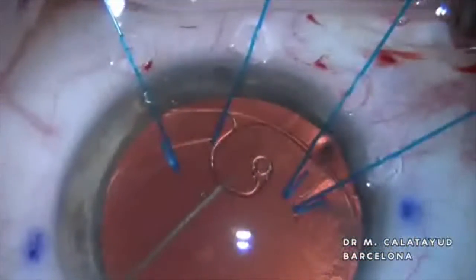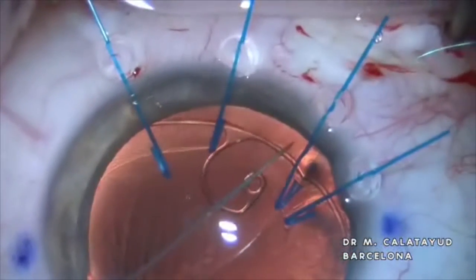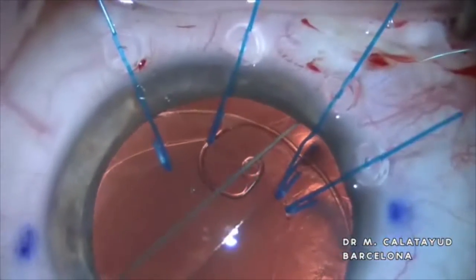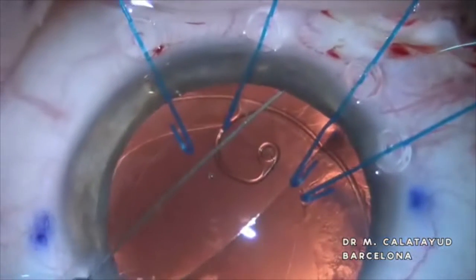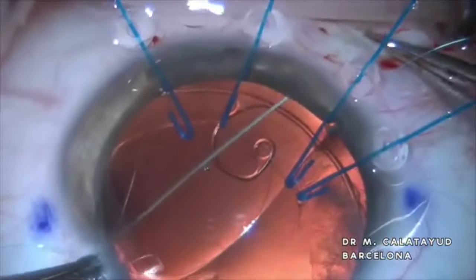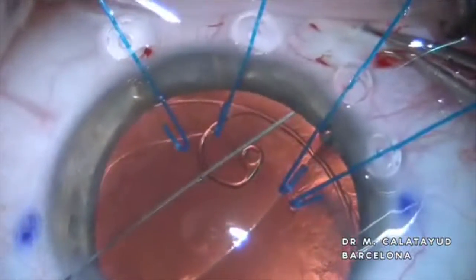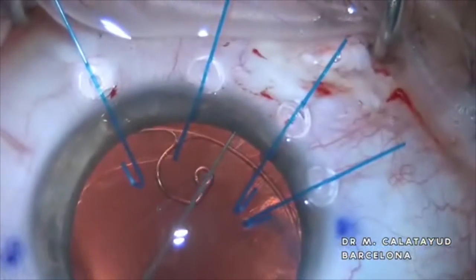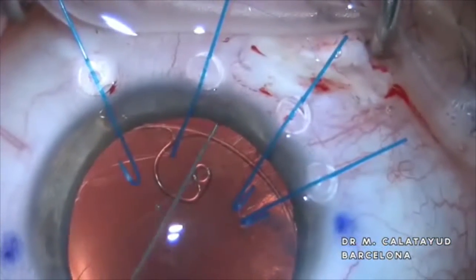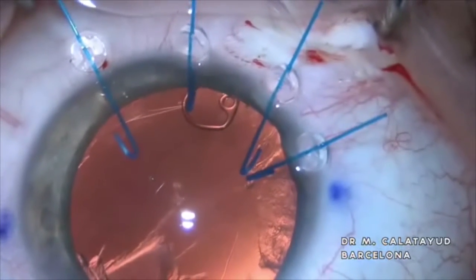Only the fact of introducing the ring reduces the subluxation. But now we are going to pass the two needles of a 10-0 prolene through the scleral tunnel to suture it and fix the ring to the sclera horizontally. It is recommended to ensure at least 6 to 8 suture knots.